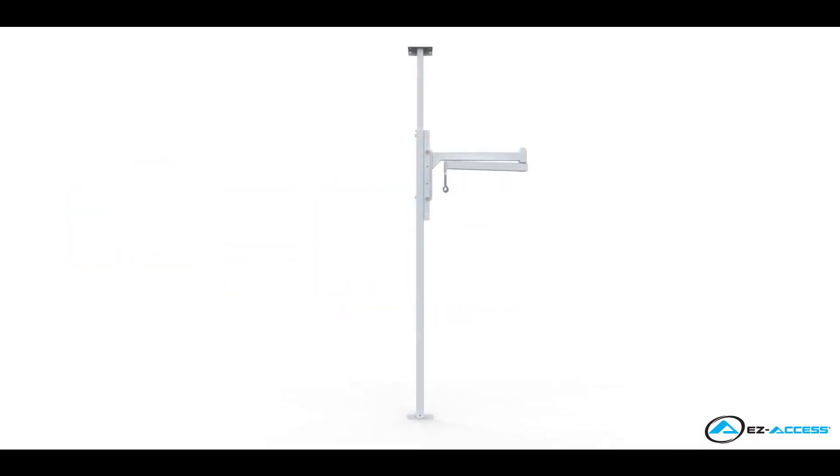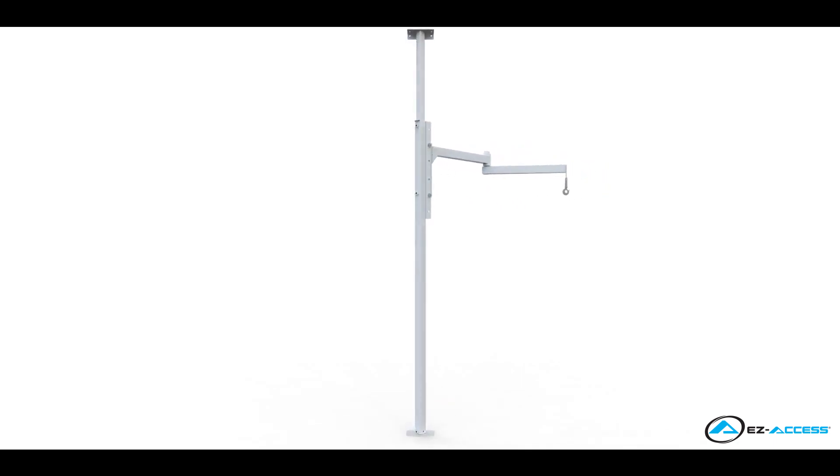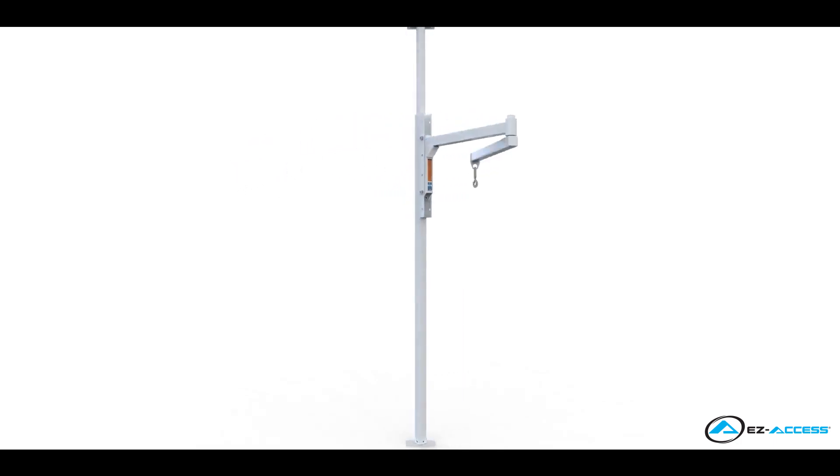This unique patient transfer lift features an articulating arm and a pivoting stanchion that each rotate 360 degrees to provide precise, all-around flexibility, even in tight spaces.